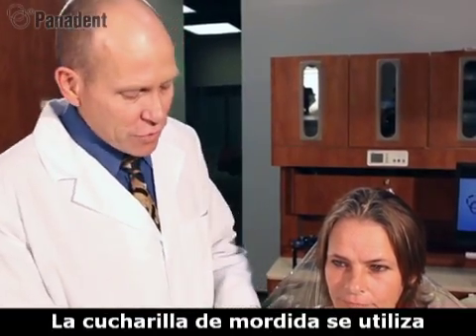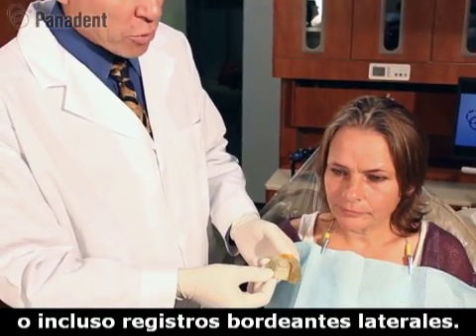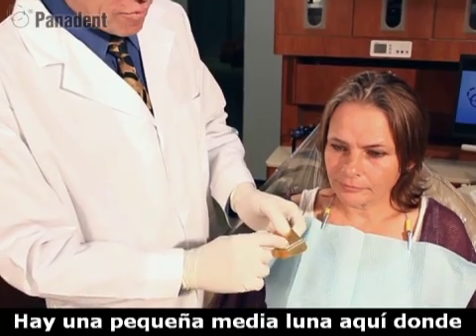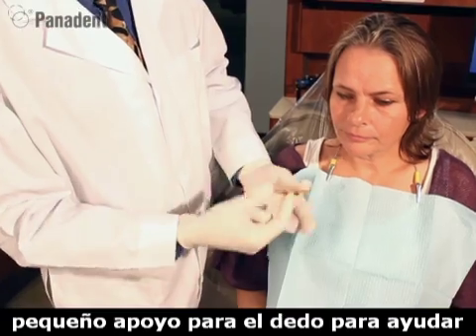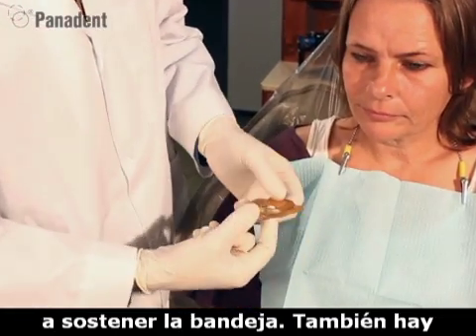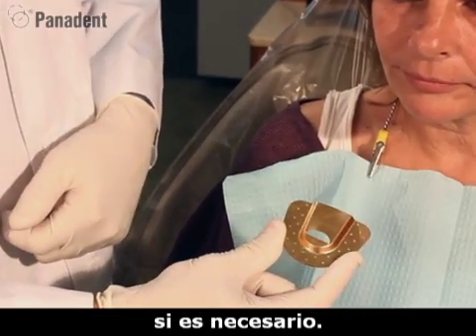The Bite-Tray is used for doing interocclusal records, such as centric relation, protrusive, or even lateral border records. There is a little half moon here that you can push down and then bend forward to create a little finger stop here to help hold the tray. There's also little serrated edges on the side where you can grab the tray if you need to.